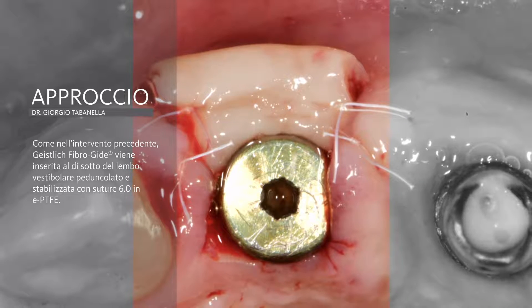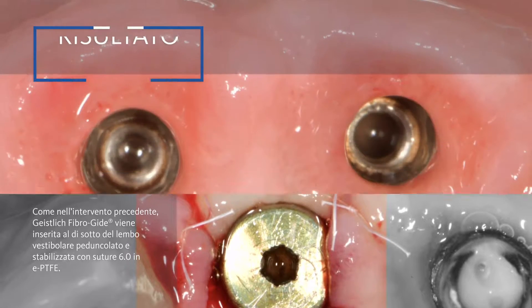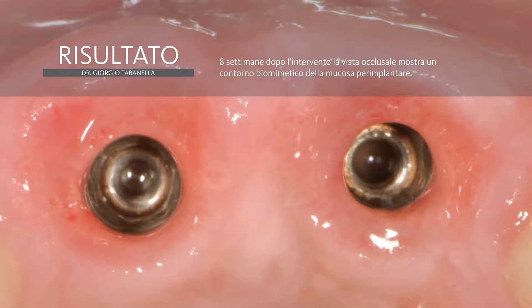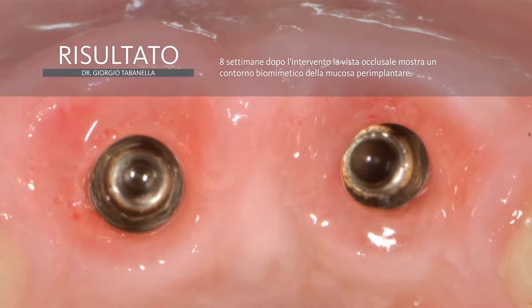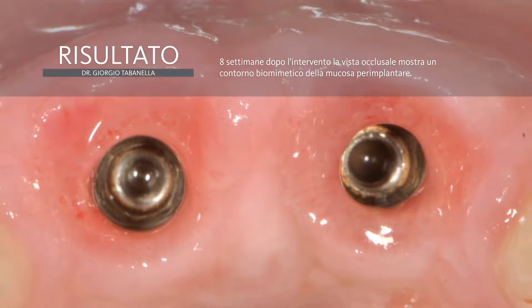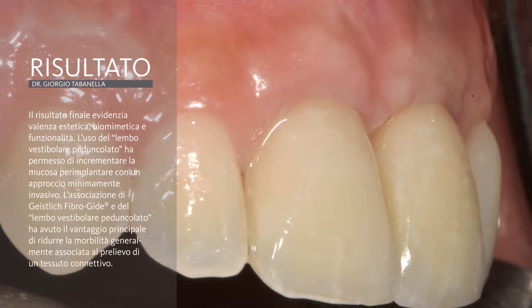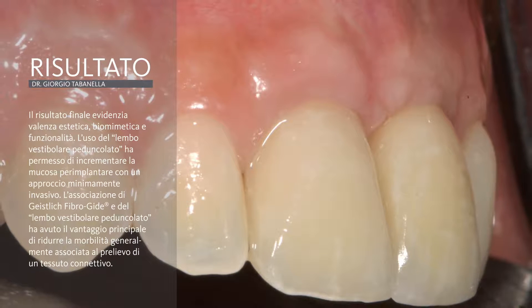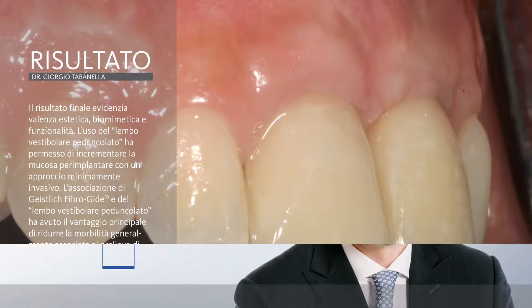I'm going to use monofilament sutures. This is the result after both buccalpedical flaps, eight weeks after, allowing the tissue to mature properly. We have a good thickness of the peri-implant mucosa, a good band of keratinized mucosa, and a good biomimetic outcome at the level of both central incisors after this long period of treatment.